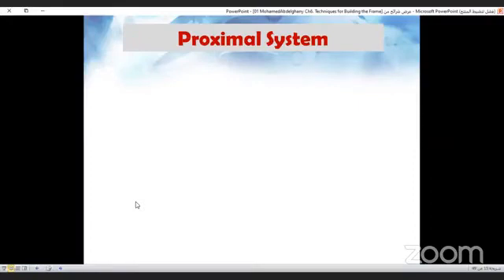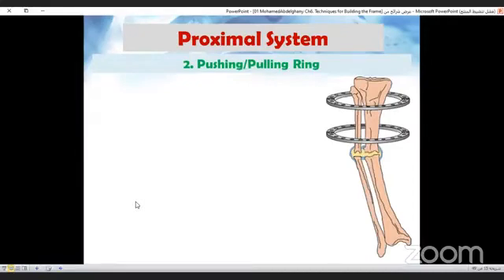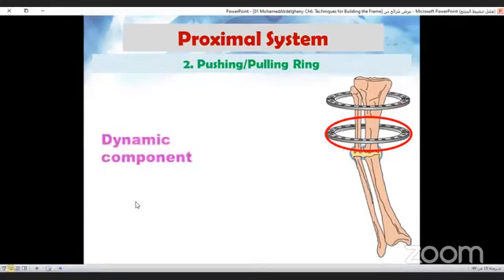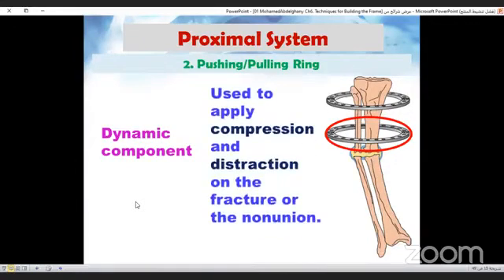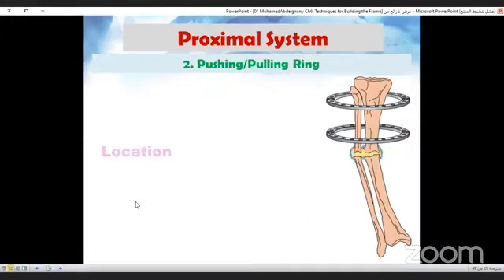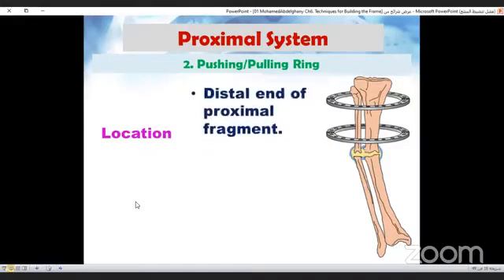Now the second ring in the proximal block is the pushing pulling ring. This one in the circle, the red circle. This is a dynamic component of this block. It is used to apply compression and distraction on the fracture or nonunion site. This pushing pulling ring is applied to the distal end of the proximal fragment to achieve stable fixation.